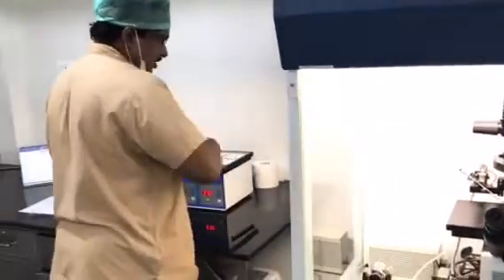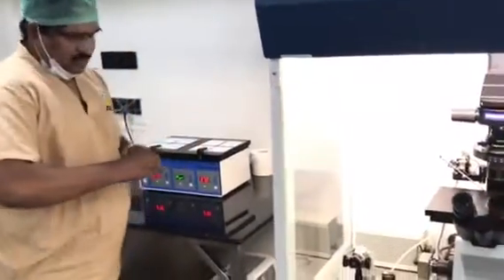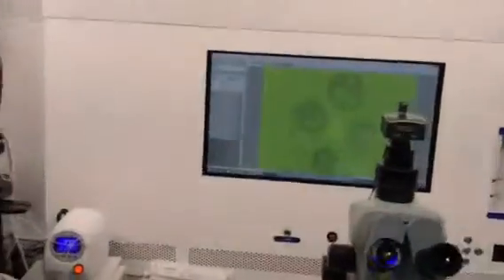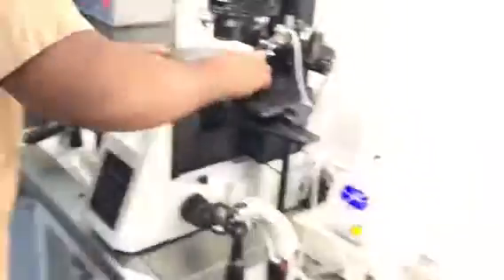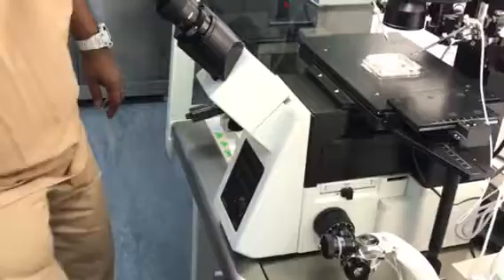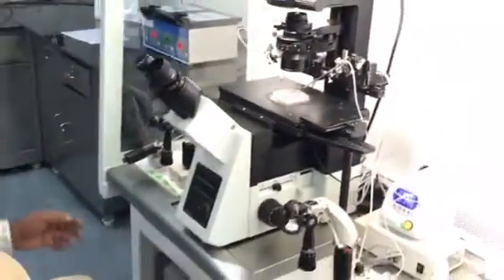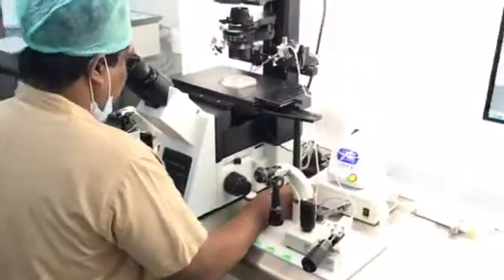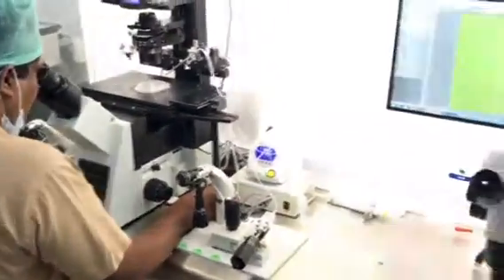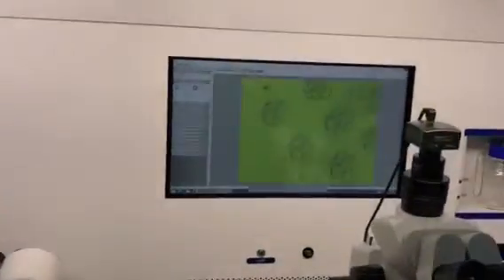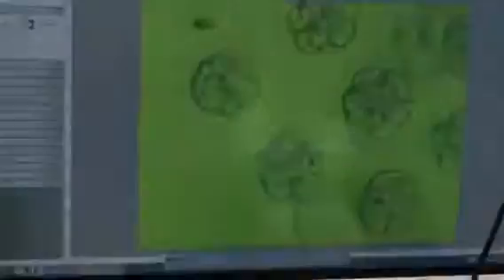This patient may be an oocyte donor or something — I'm not sure, we'll check later. Now I am going to record the IVF embryos.